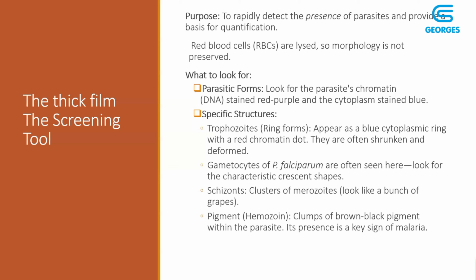So let's quickly go to the thick film. The thick film is considered a screening tool. And why? Because the thick film is used to rapidly detect the presence of parasites. It provides the basis for quantification. On the thick film, the cells are lysed, so the morphology is not well preserved.